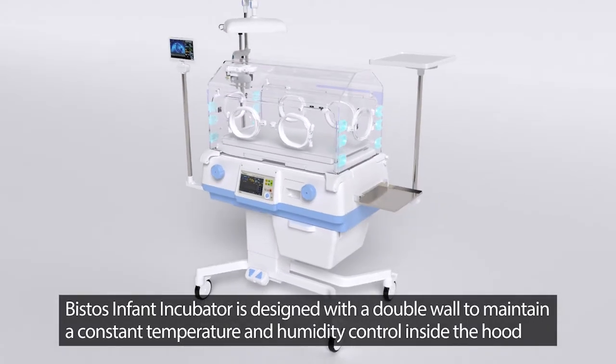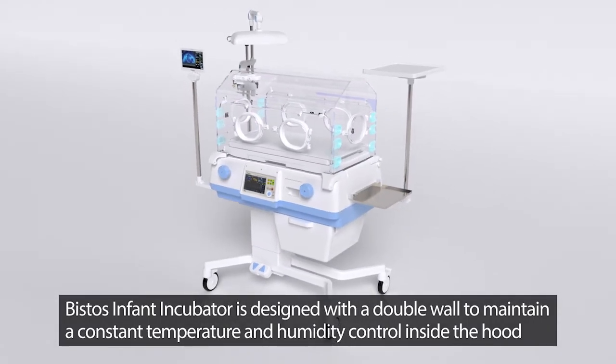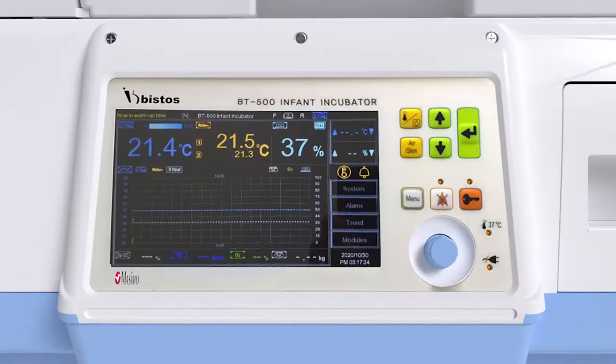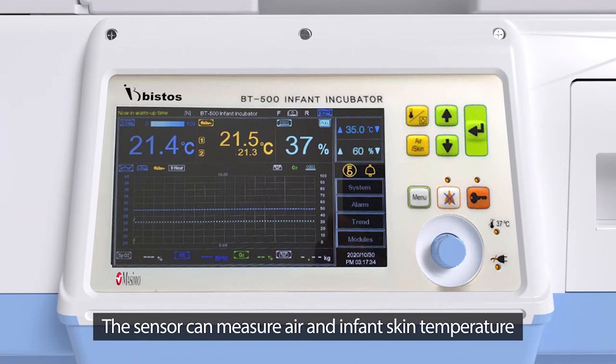The Bistos Infant Incubator is designed with a double wall to maintain a constant temperature and humidity control inside the hood. The sensor can measure both air and infant skin temperature.